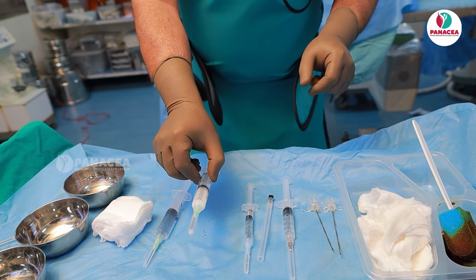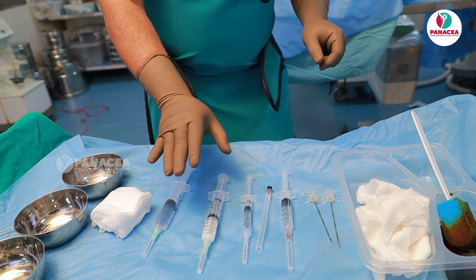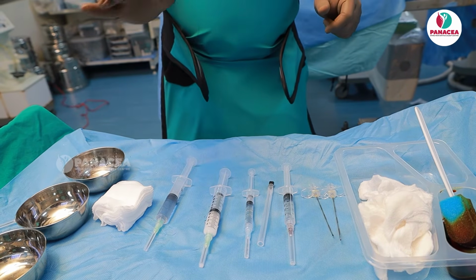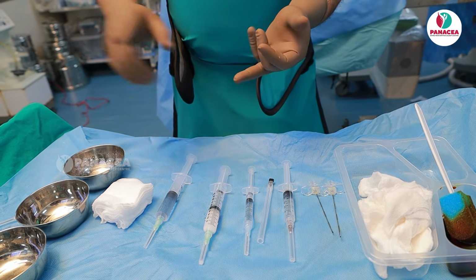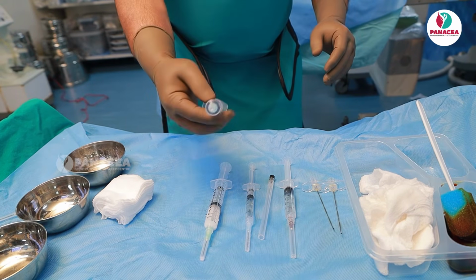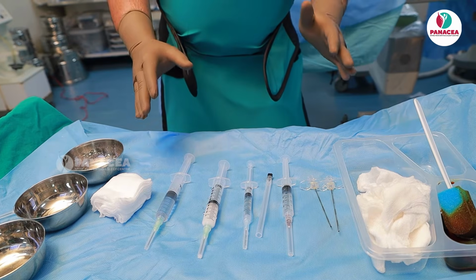This is 0.2% ropivacaine with Depo-Medrol. You can use either particulate or non-particulate, but the safest above the L3 vertebral body is non-particulate, that is dexamethasone. But if you are giving below L3, it is up to you. You can use triamcinolone, methylprednisolone, or dexamethasone. All have the same efficacy, there is no harm. And here comes the saline. We even give a saline purge in order to dilute or flush away all the inflammatory markers.